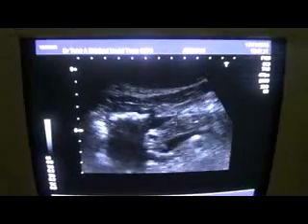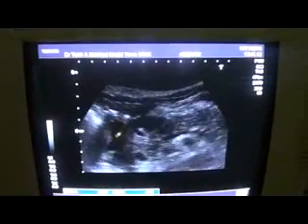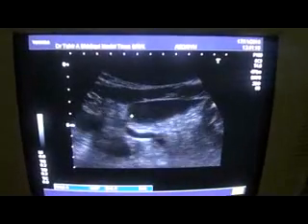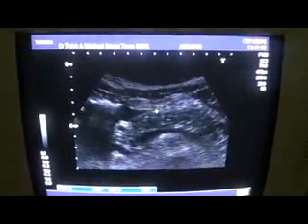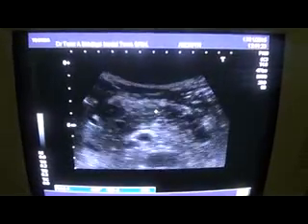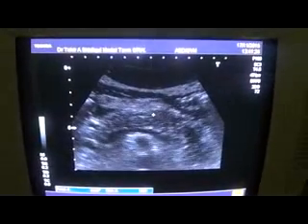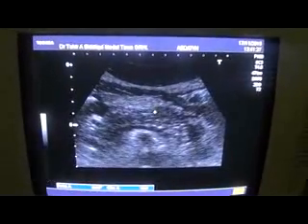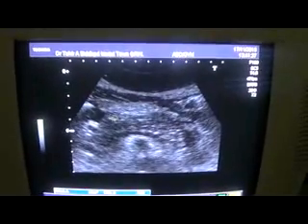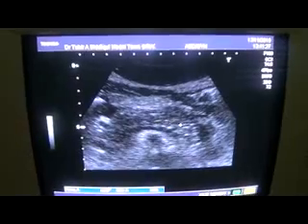Now, why is there fluid here? You see, this is fluid. This is fluid. Then this fluid here is around the pancreas. If you see concentrated, that shows tiny echogenic particles within the body of the pancreas as well.